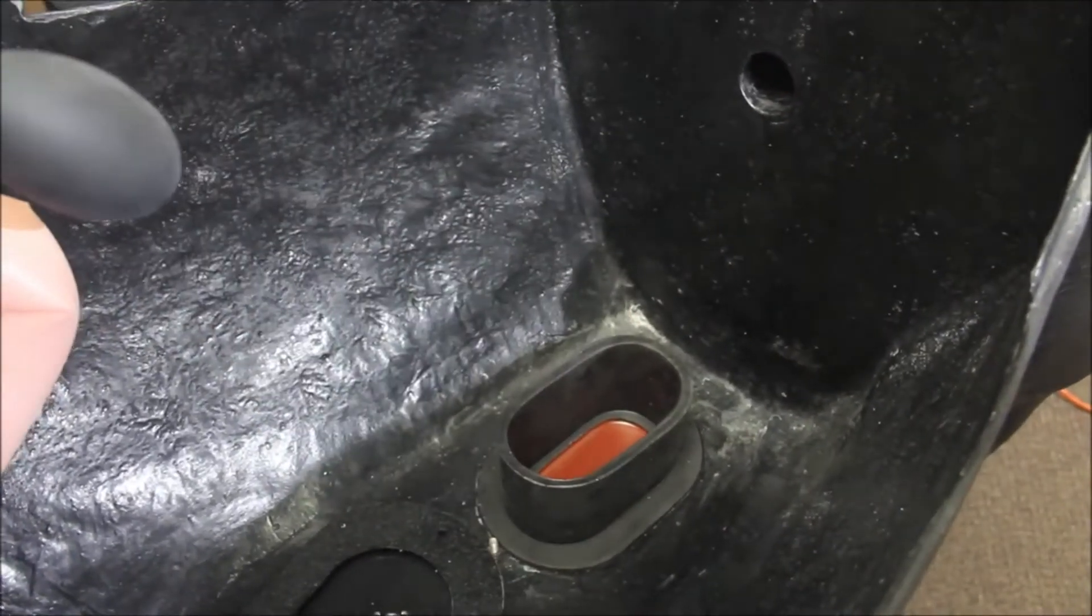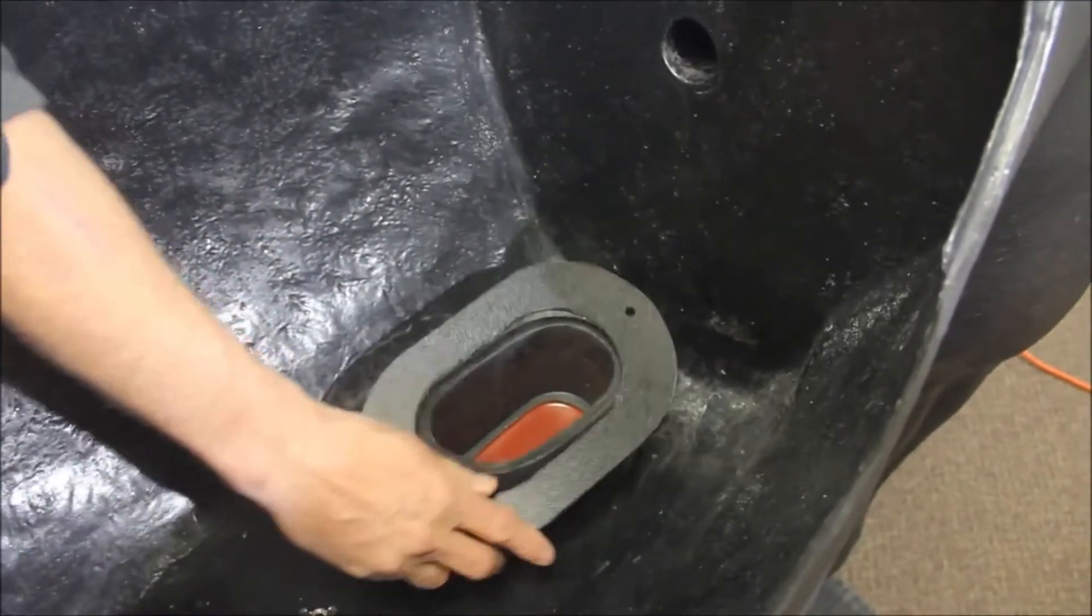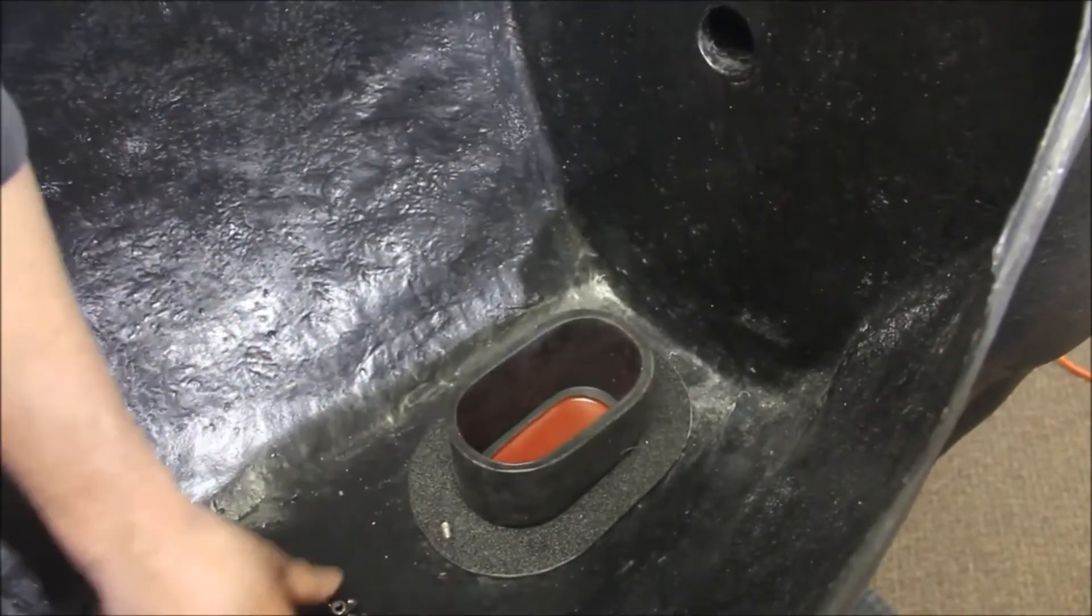It snaps into place and sits flush with the belly of the horse and is held in by a plastic ring and two wing nuts.